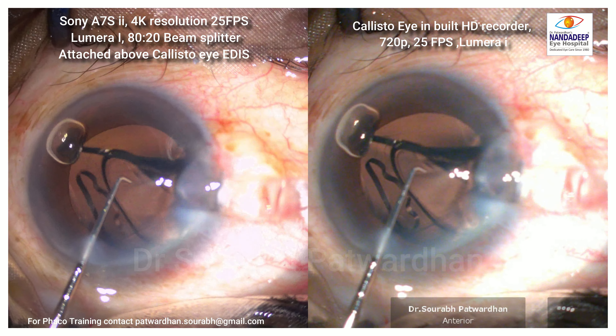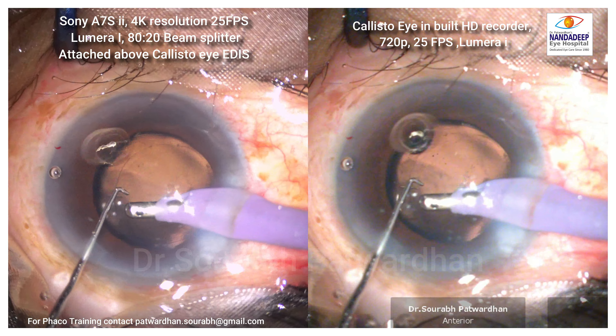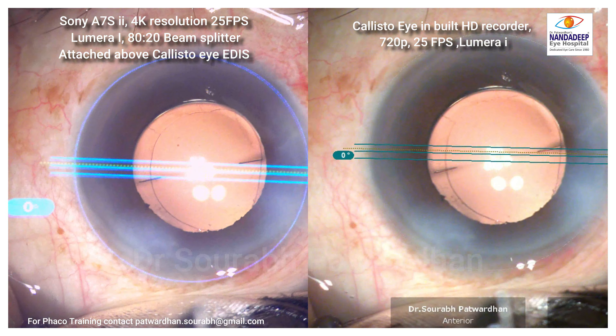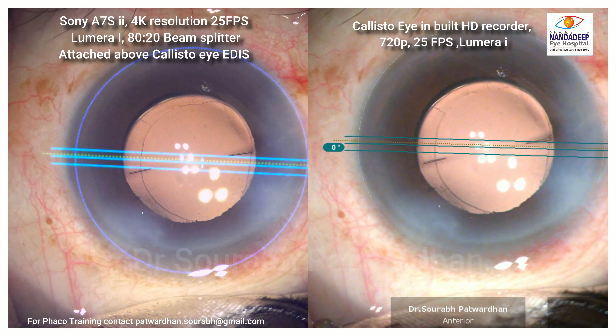The washout is more pronounced with the Calistoi recorder, while the Sony A7S2 has more dynamic range. Here you can see the moment the overlay is on, the slight bluish tinge appears on the Sony A7S2 side.